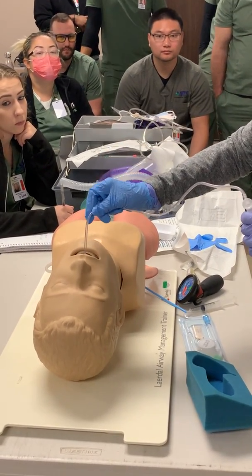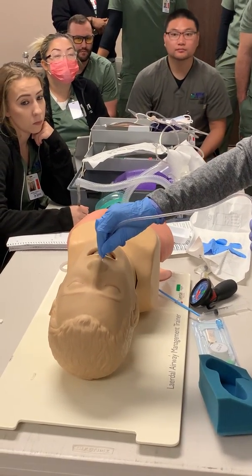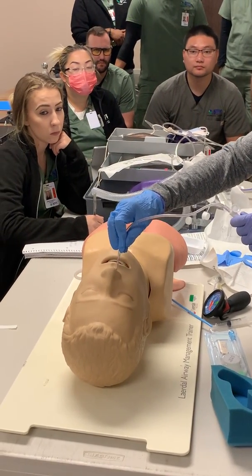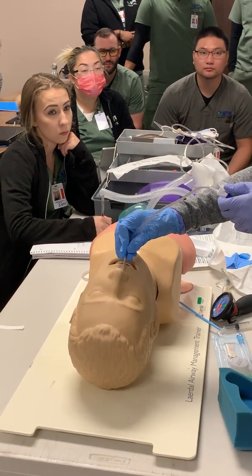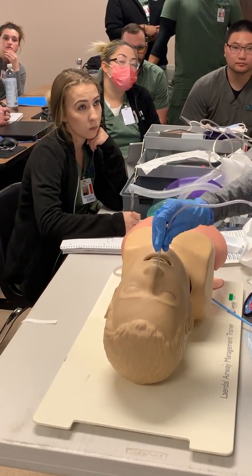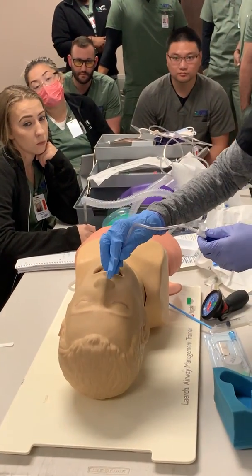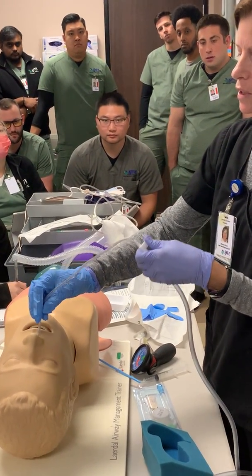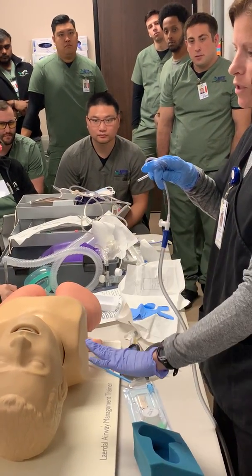So I'm gonna put in the catheter. And sometimes if you hit some resistance, you kind of give it a little twist. And you're gonna get to a point where you're gonna hear actually a change in breath sounds through the thumb port. You'll kind of hear like somebody's taking a breath in. When you hear that sound, then that's when you advance the catheter even more. In the real world, they'll already be coughing. Then I occlude the thumb port, I pull the suction catheter out, and I wrap it back up in my hand. I let the patient get a breath.